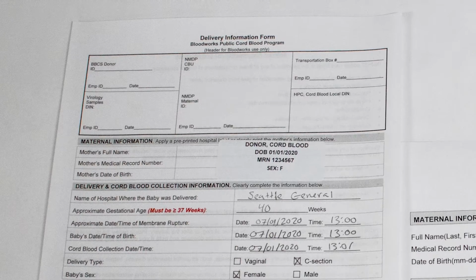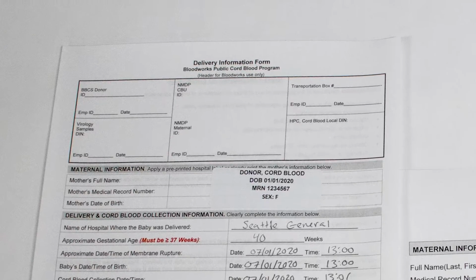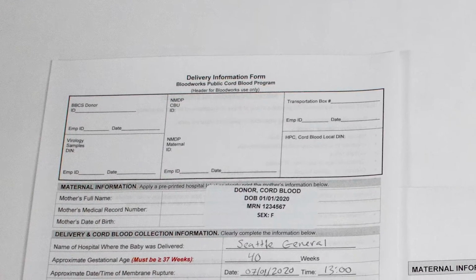This is the delivery information form. This can be filled out after the baby has been born and the cord blood has been collected. This must be entirely completed. At the top part here, a hospital label can be used instead of filling it out by hand.